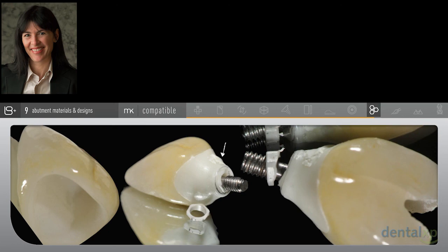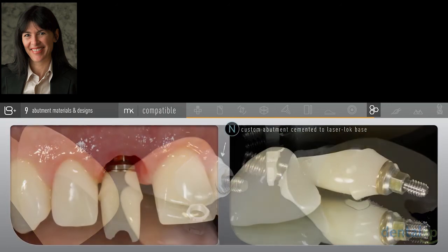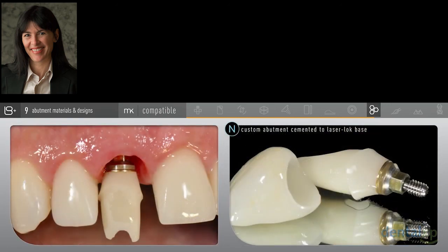So what I deal with as a periodontist is I get implants sent into me with problems, peri-implant mucositis and peri-implantitis, and I know Glenn's going to be talking about that. It's a big problem today, and I am convinced, although it's multifactorial, that this is one of the big issues, is cement trapping. So today, when we're working with our transmucosal materials, we're looking for abutments that are aesthetic, whether they be lithium disilicate or zirconia, but on a metal base. And there are interesting metal bases. This one happens to have a laser lock on there, which we think might be of value to us in the long run in terms of soft tissue health.